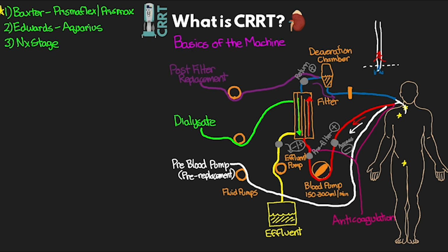So hopefully this lesson at least gave you a good understanding of, again, what exactly CRRT is, the indications and why we're using it, and then gave you a good overview of how this circuit is set up, so that as we talk through some of these next steps, you'll have an understanding of where this stuff is taking place.